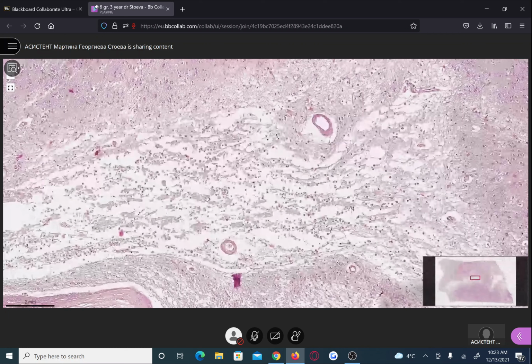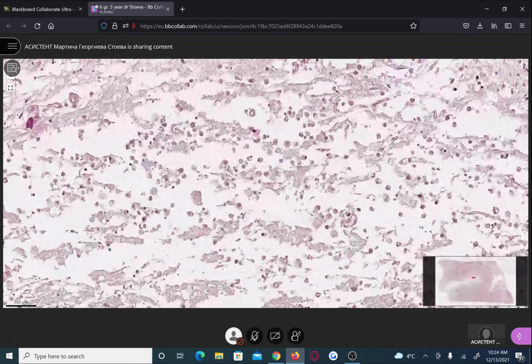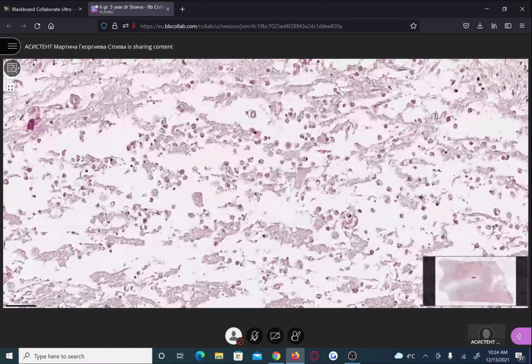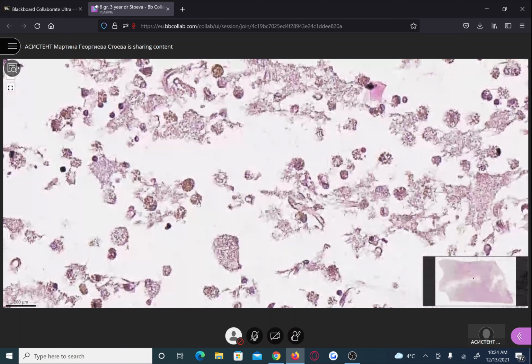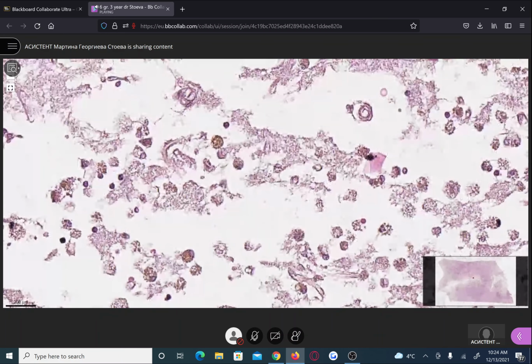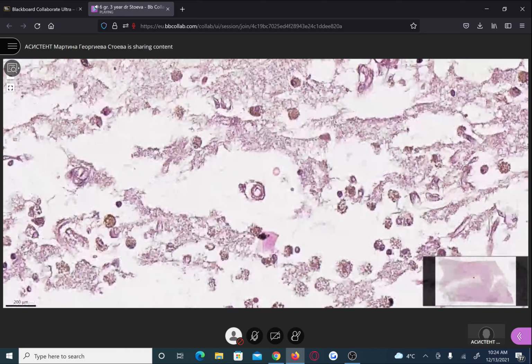You know that in the brain, both types of infarctions are possible, anemic and hemorrhagic. So finally, based on the presence of the type of macrophages within the cavity that is finally left from the infarction, we can say what was the type of the previous infarction. So here, in the case of so many siderophages within the cavity, means that the infarction was hemorrhagic. Because only in the hemorrhagic infarction there is leakage of erythrocytes within the necrotic area.